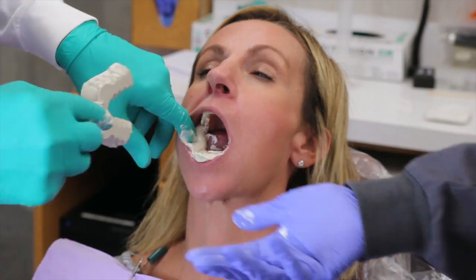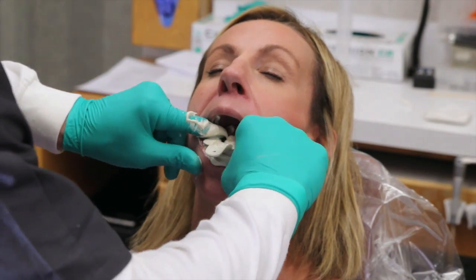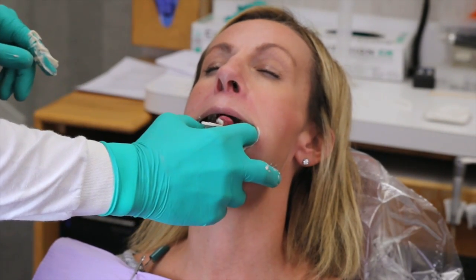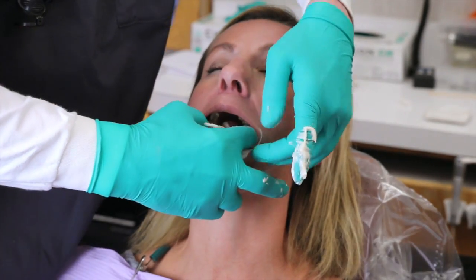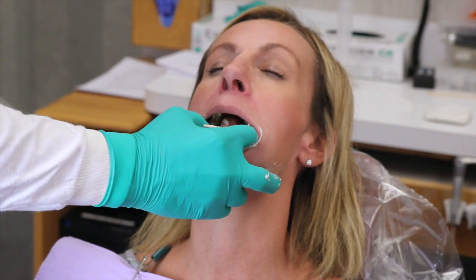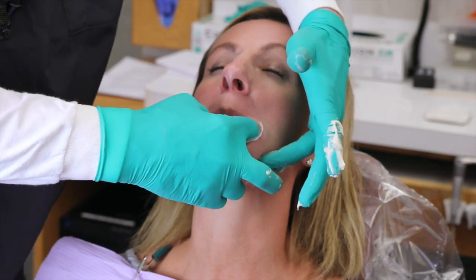And we then load the tray in, tongue up to the roof of your mouth. Seat the tray anteriorly first. Stick your tongue way out. Wiggle your tongue. Great. Kind of border molding the lingual area. Can you wrap your lip over the front of that? Good. Yeah, the patient kind of bring your lip again up over the lower tray. Good. We'll kind of border mold this as we're going.